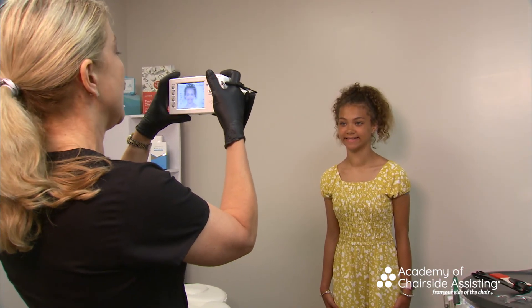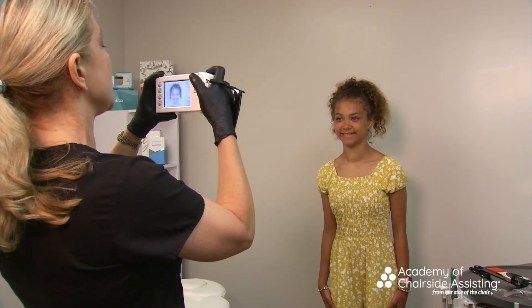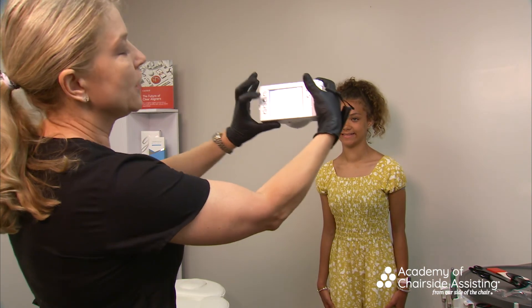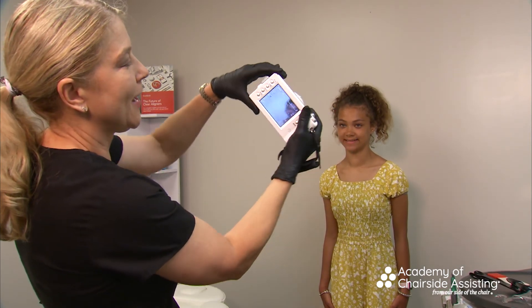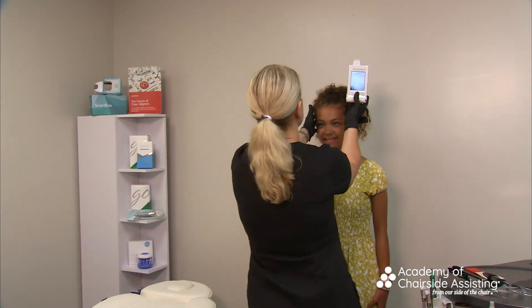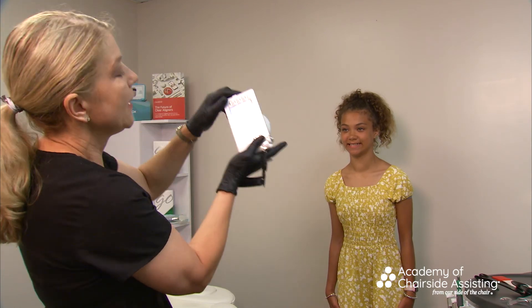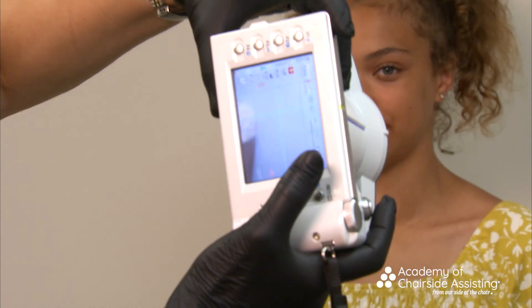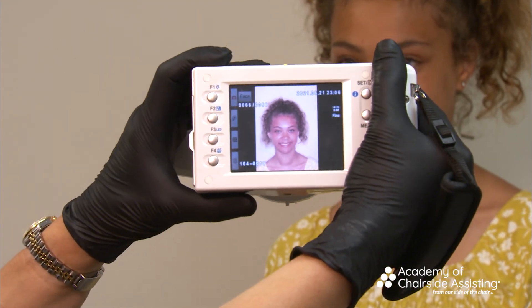I'm going to touch the camera to activate it and back up just a little. Notice the grid — it helps me line up the shot. If I tilt it sideways an indicator shows I can't shoot straight across, so I need to level it. Okay Kylie, big smile — lift your chin just a hair. Beautiful! You can see how gorgeous that is. I've got a little space with her from the shoulders up. Ideally the whole series takes about five minutes, but since we're showing each step it takes a bit longer.